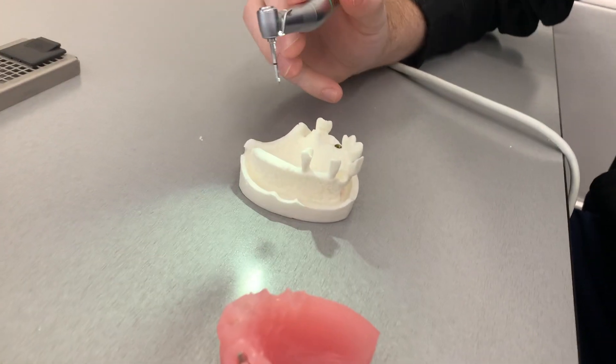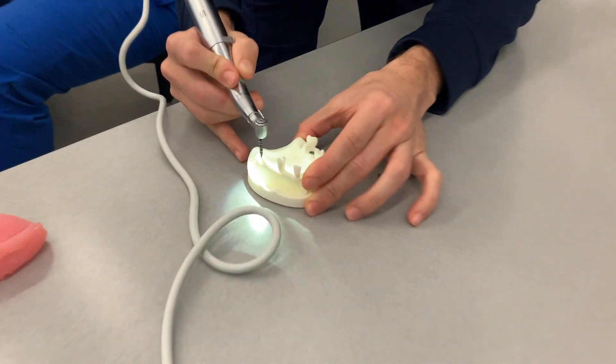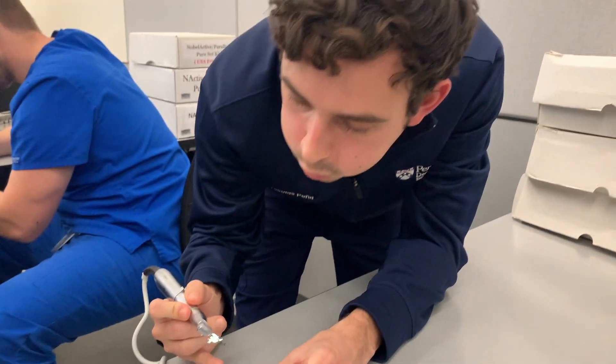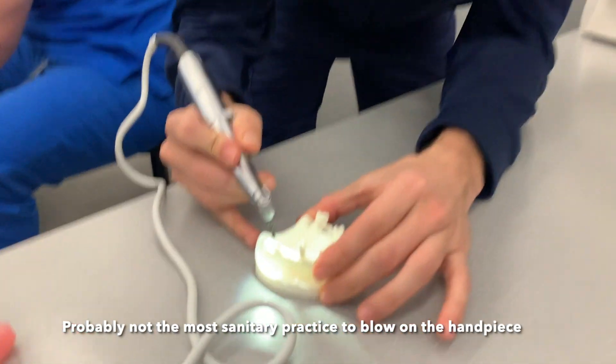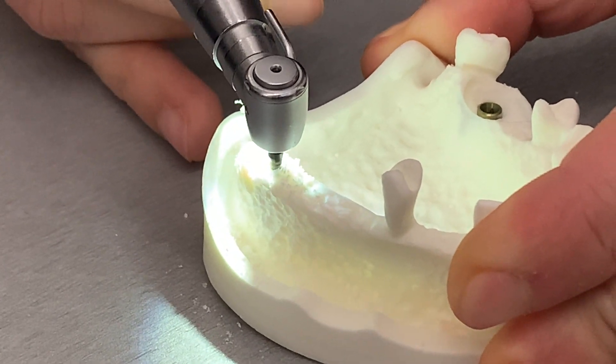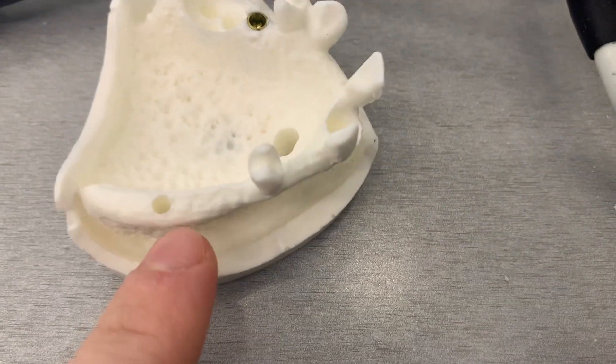Now we're placing implants — let's go! Learning about implants as a D1 student, let's go. I just widened my hole right here and now I'm getting this drill bit and putting my actual implant on — that's how it's supposed to look, perfect.